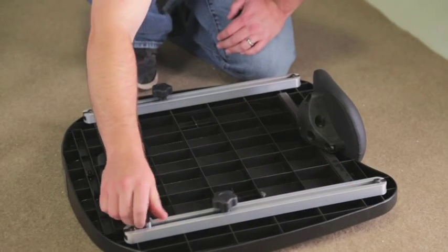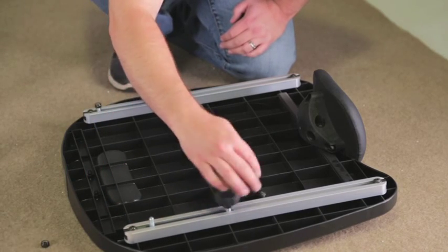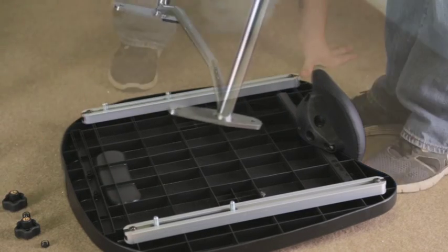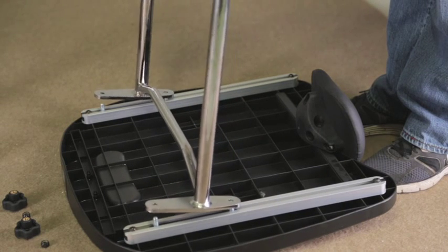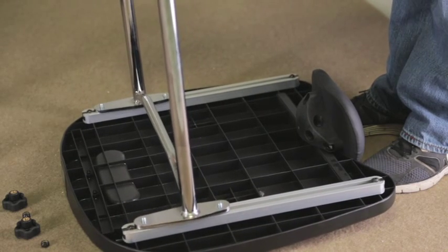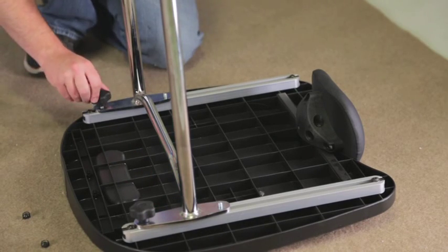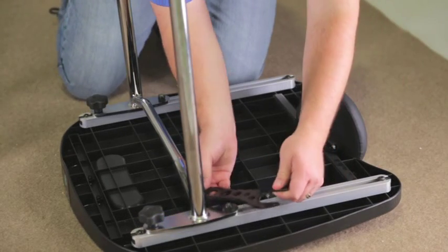Place the tray upside down. Remove the knob and nut from both tray slides and set aside. Place the tray bracket onto the bolts with the shorter end of the bracket facing the chest pad. Place the knob onto each bolt on the longer end of the bracket and tighten snug. Place the nut onto each bolt and tighten until the thread is exposed.